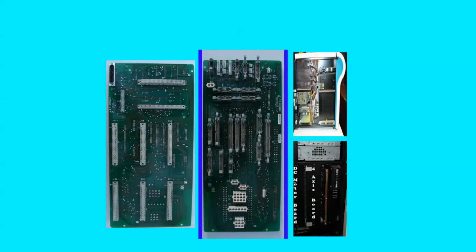Here is a list that I'm going to briefly state of all the boards that go into the motherboard. J1 goes to the fuse board, which has 4 voltages on it, +26 volts and 28 volts AC. J2 is the switching power supply, which gives you the +5, the +12, and the -12. J3 is a fuse board, which has voltage supervisors for the +5 volts, the +12 volts, and the -12 volts. This is also the vacuum pump control.